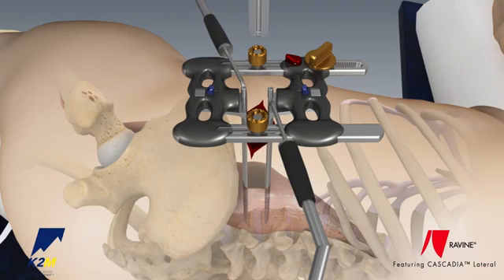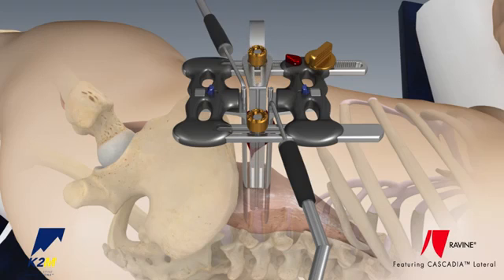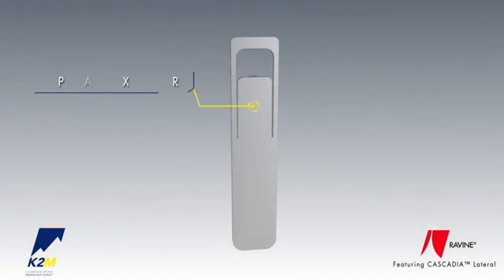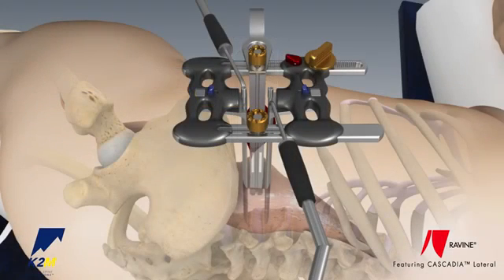If more soft tissue retraction is desired, blades for both the anterior and posterior aspect of the frame are provided. The corresponding AP blade is introduced into the incision, drawn back along the frame's AP adapter and locked into place. If the optimal AP blade length falls between the lengths available, an AP blade extender can be inserted down the channel of the blade using the intradiscal shim inserter. The AP blade extender allows for lengthening in 2mm increments.